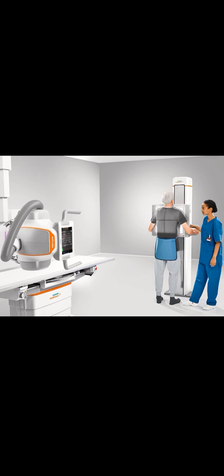In this lecture, I will explain to you how we will take the posterior anterior radiograph of the chest. But before going towards the posterior anterior radiograph of the chest, allow me to explain what is posterior anterior and what is anterior posterior.